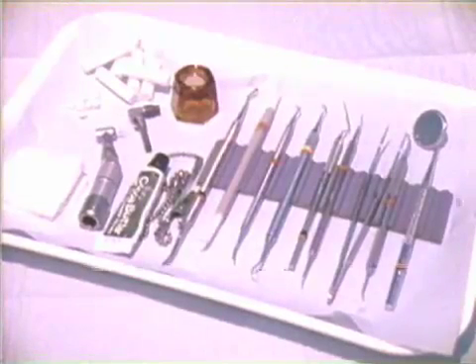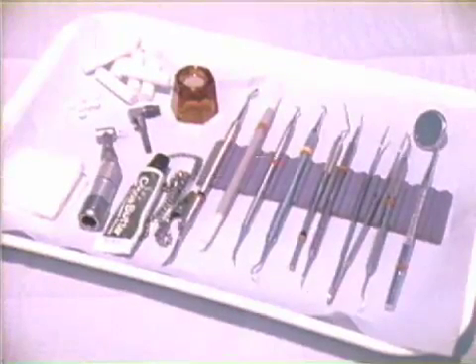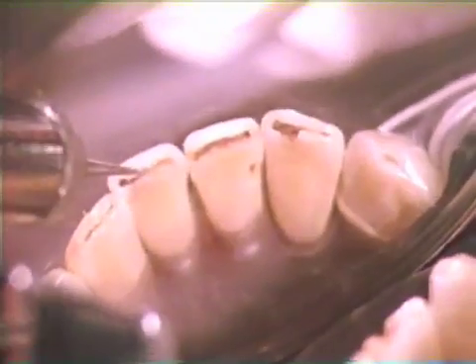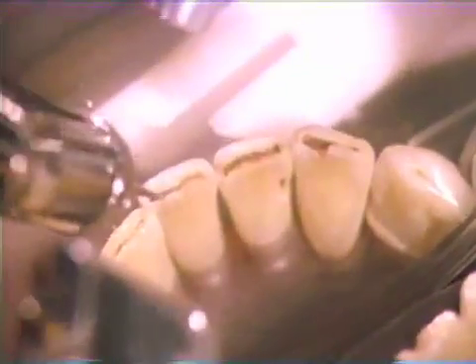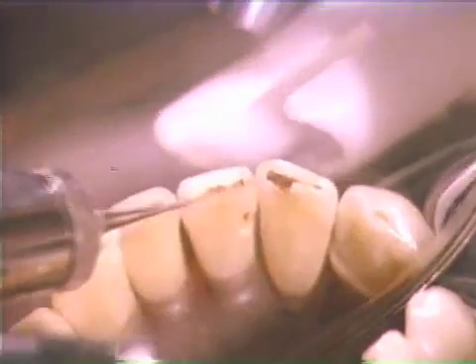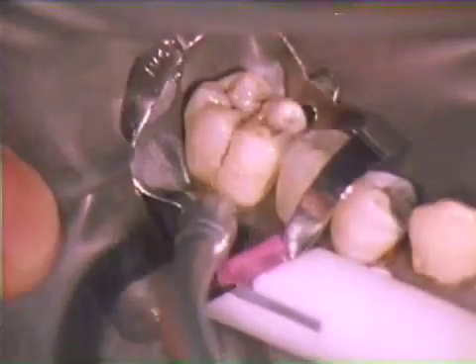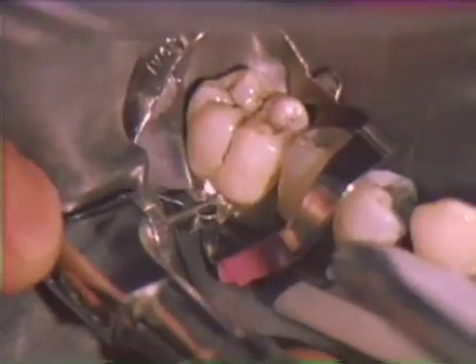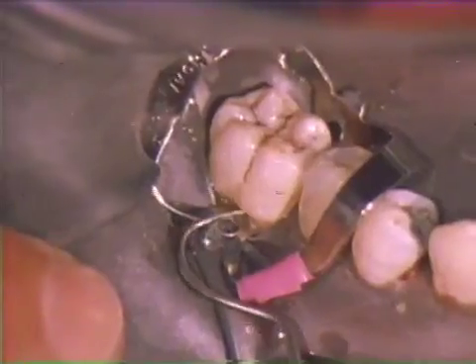Tray setups for glass ionomer restorative procedures are similar to those needed for composite resin restorations. Cavity preparation prior to placement of the glass ionomer restorative material is minimal. As illustrated here, a small round burr is used to remove only decay and unsupported tooth structure in keeping with accepted principles of operative dentistry. Mechanical undercuts are not placed since retention will be obtained through chemical bonding of the glass ionomer to the exposed dentin and cementum. On excessively deep caries excavations, the dentin should be covered with calcium hydroxide.